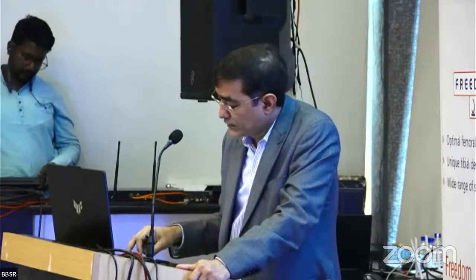So now coming to a few cases. Here, if you see this deformity, it had a sagittal plane deformity as well as a coronal plane deformity, but the sagittal plane deformity was much more. And if you draw the line, we are not cutting the collateral. So here we used navigation and did a knee replacement. Another deformity, in which again there was a nail in situ also. Here again we draw the line and you see. So you have to draw this line, whether you're using navigation, robot or anything.